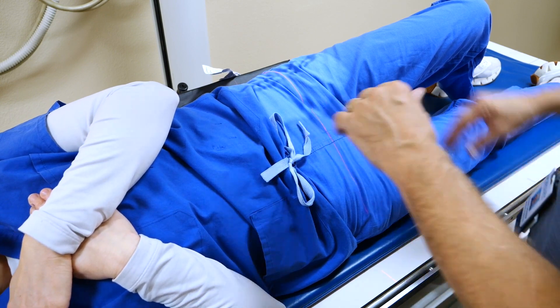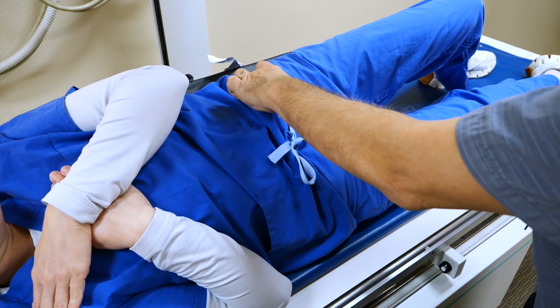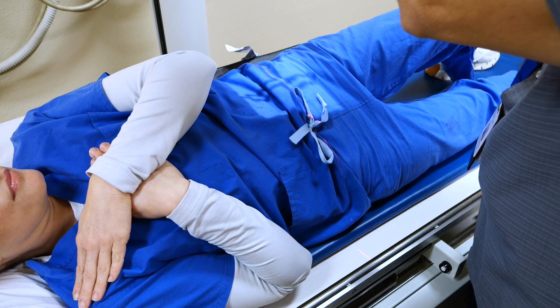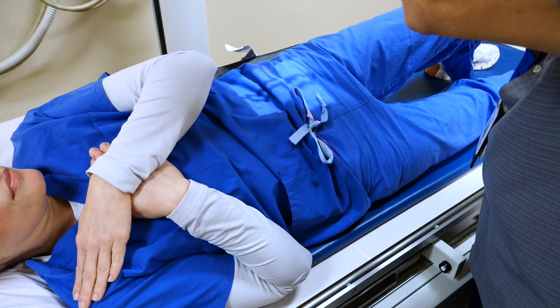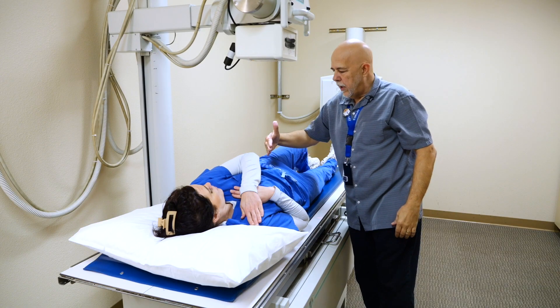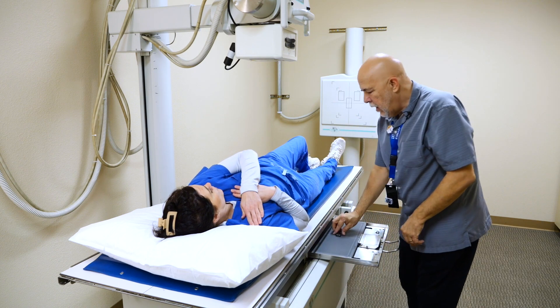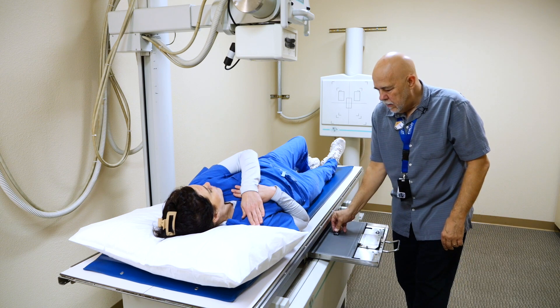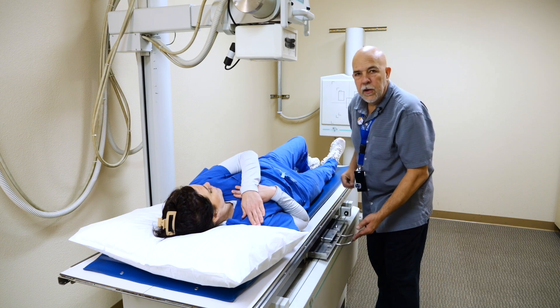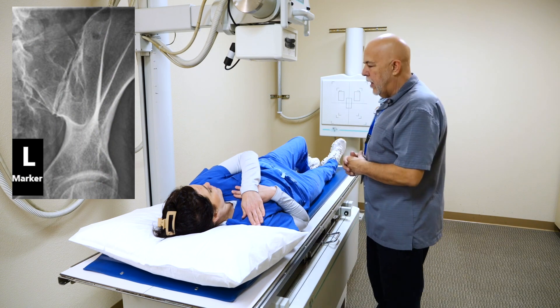Our centering point is one inch medial to the elevated ASIS. I'm going to push on the ASIS, center one inch medial. You can collimate down fairly tight, but you do want to make sure — because the ASIS is not straight, it kind of goes at an angle — so you want to make sure and have it open enough to get both sides. I always put my marker on the medial side because your SI joint kind of goes this way; that'll keep it out of the way of the image. And expose our image. That is the left SI joint.